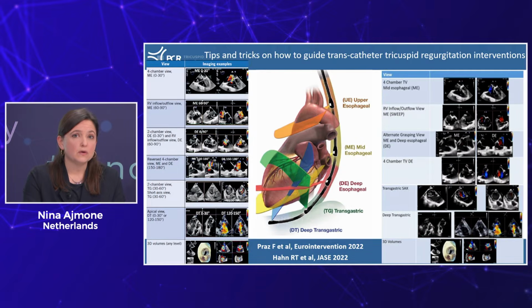All the experts, both from Europe and from America, have already published sorts of guidelines on which images you should use, could use, and should master to guide the procedure. But if some of those are not possible, you can, of course, use others. So I really suggest you look at this whole approach, and we will now go through the steps of it a little bit.